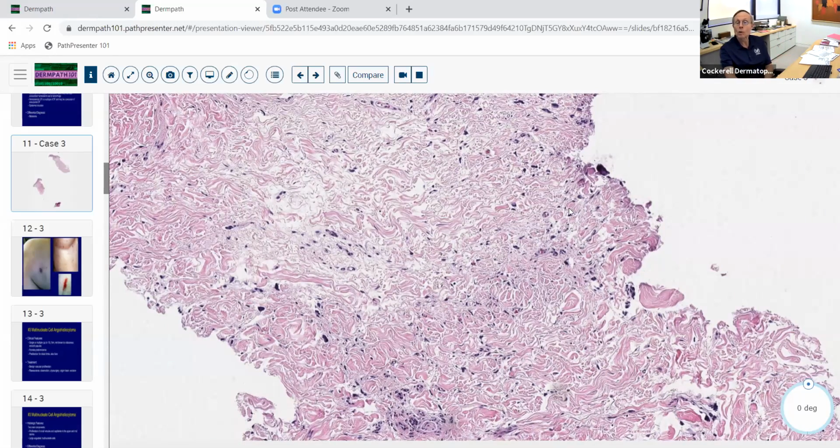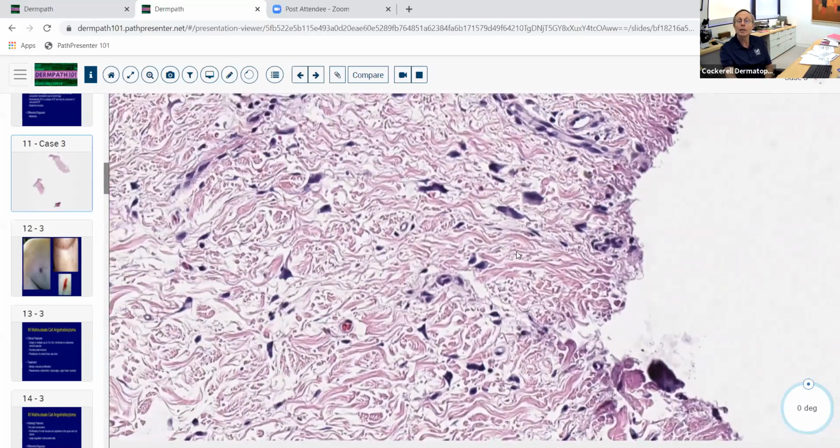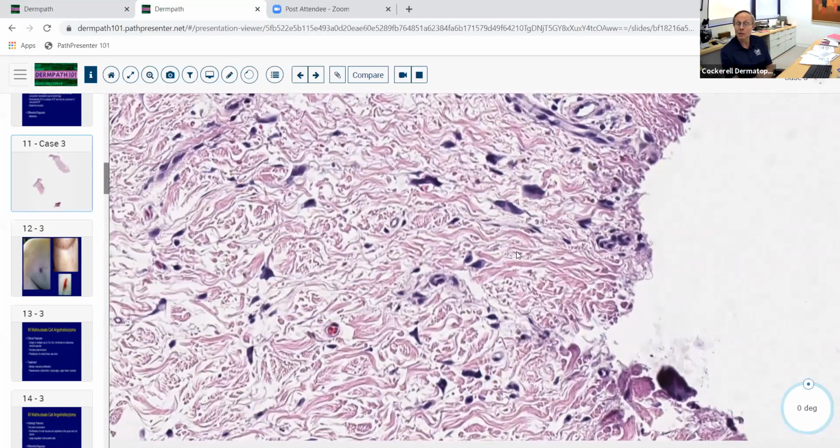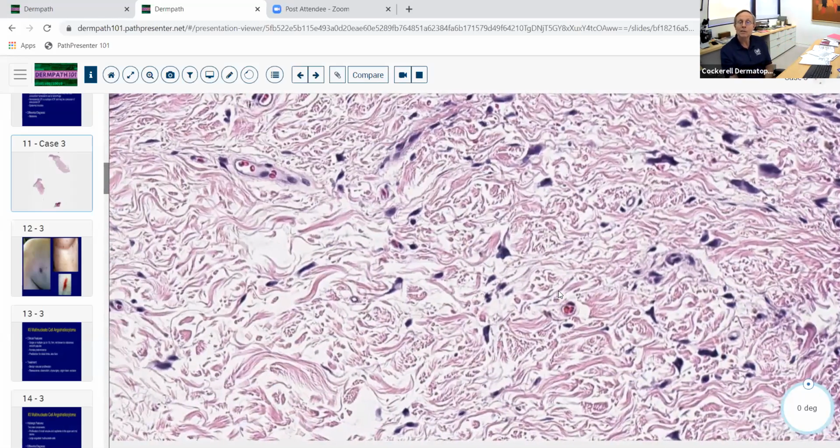It's an interesting rare entity. If you're going to learn about this entity, you need to be able to recognize these kind of cells. They have these little multiple nuclei in them. They're admixed with cells that have kind of a spindle cell and angulated morphology, sort of like the dermatofibroma a little bit. Then we've got the blood vessels in there. So that's why we call it a multinucleate cell angiohistiocytoma. And histiocyte just means a cell that's kind of like a monocyte macrophage that's living in the skin and the tissue. So that's basically what this lesion is.